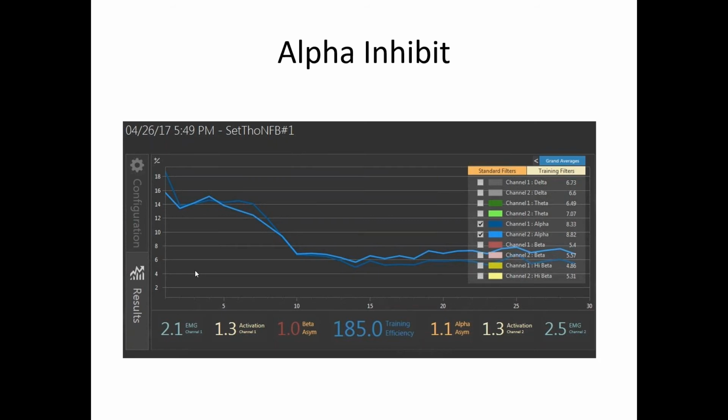And that was a big question for a long time until we ran a lot more stats and saw a lot more screens. But we had to have a standardized system to see this stuff, which is what we tried to do at NewMind. I think Thatcher's trying to do the same thing too, and he's just doing it in a different way. But we're all moving in the same direction, and we'll see which one pans out, which parts of each one panned out the best. But ours aims for simplicity because we're dealing with clinicians and not researchers and geeksters.